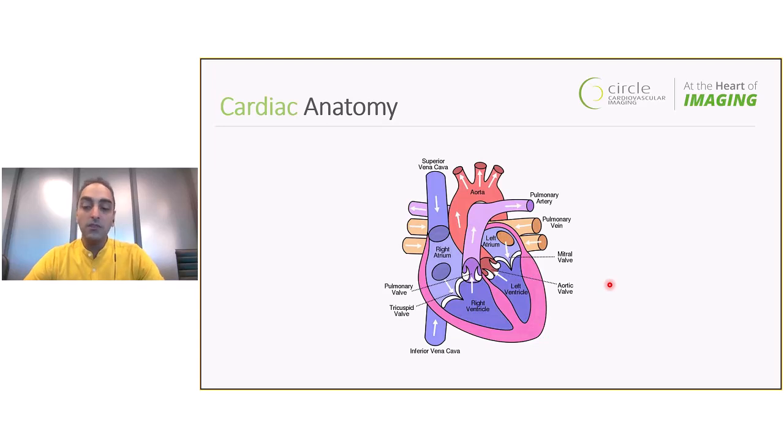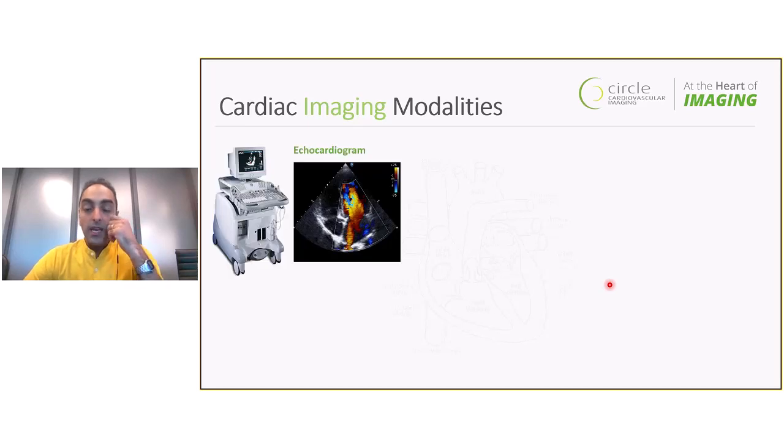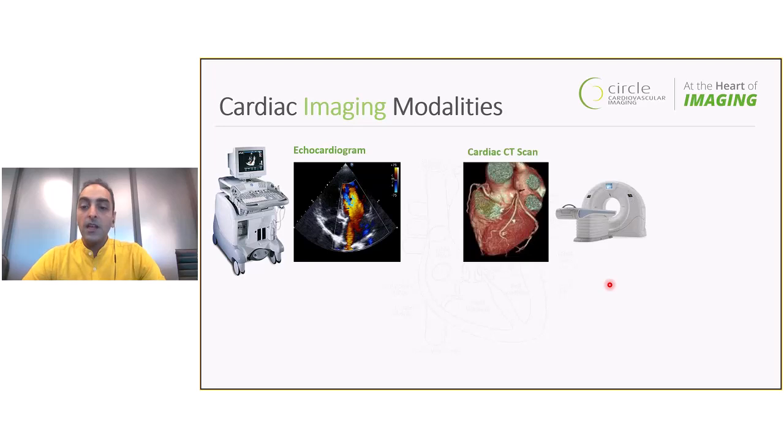To do this, cardiologists typically employ multiple different tests, which include medical imaging modalities. For example, they might do an echocardiogram, which uses ultrasound waves for continuous monitoring of the heart chambers and visualization of blood flow. However, if this is not sufficient, if they suspect another problem with the patient, for example, coronary artery disease, they might decide to do a CT angiogram.